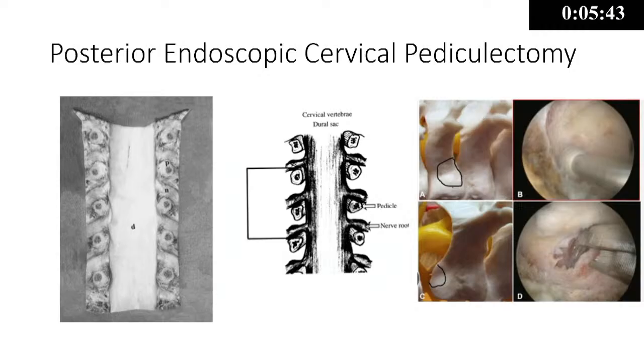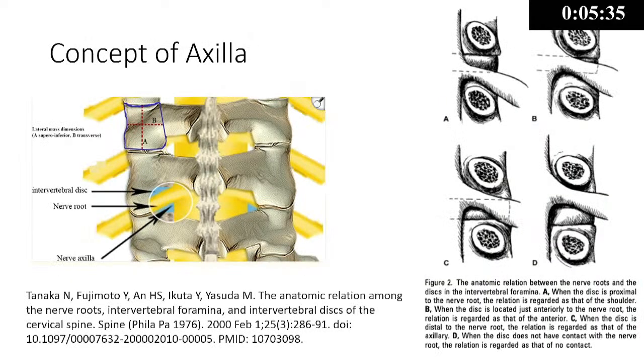Actually, in the cervical spine, if we retract the nerve more, there are chances of traction and injury. To avoid that, we have to do some amount of pedicle resection also. So from the superior articular process and inferior articular process, some amount of the pedicle has to be removed. It depends upon the pathology, but many times we have to do a medial pediculectomy.